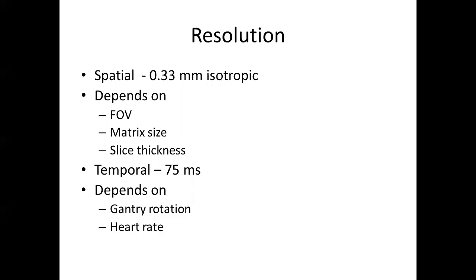And this is sort of unique to CT. Echo and MRI have decent resolution in whatever plane you're imaging in, so your X and Y. But your Z plane, which is going through, which you need to evaluate coronaries because they do lay out, your Z plane resolution is pretty poor. So they don't have isotropic resolution. This is really for CT. It's the same in every plane. Spatial resolution depends on your field of view. This will make sense from echo, when you zoom in, you improve your resolution. That's why we zoom in into valves and stuff, as we were doing with the appendage today.